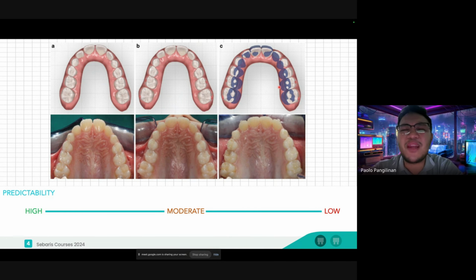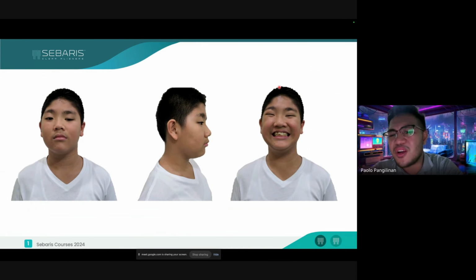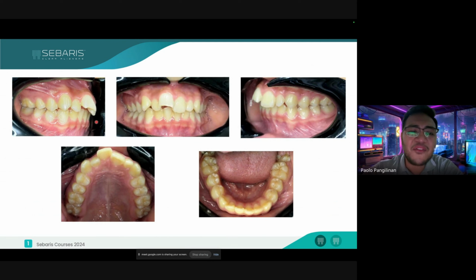I am actually blessed with some patients where, yes, I can do clear aligners from the get-go. Just like on this patient, I can actually do clear aligners for this one. But I chose, on my diagnosis and treatment planning, when I evaluated this case, I have constriction. Yes, I have a space issue here. I know I have some bone remaining here. I know I can develop the arches a little bit.